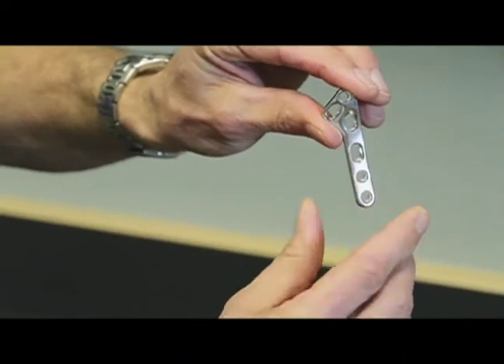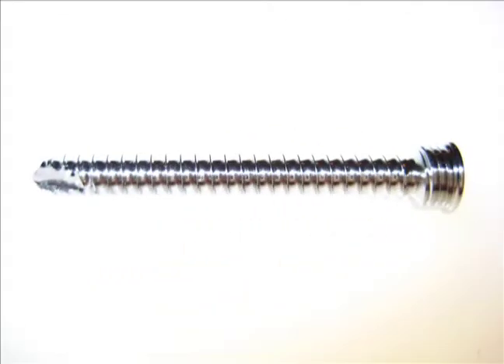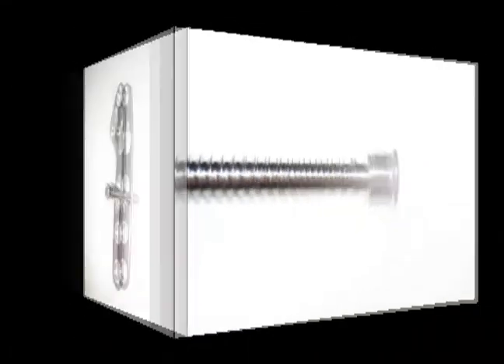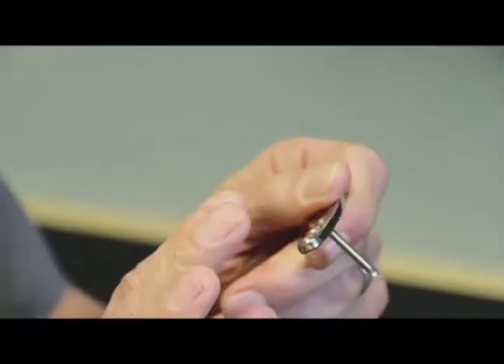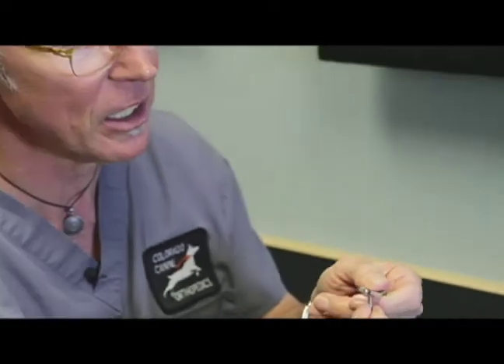Bone plates are made of either surgical stainless steel, which is most common, or titanium. A significant advancement is locking screw technology. This screw has threads on its head as well as threads that engage the bone. As we tighten it, it goes into the bone and also tightens into the plate, making it very rigid. This locking plate technology has improved immediate post-operative comfort, improved healing time, and has been a great innovation in both veterinary and human orthopedics.